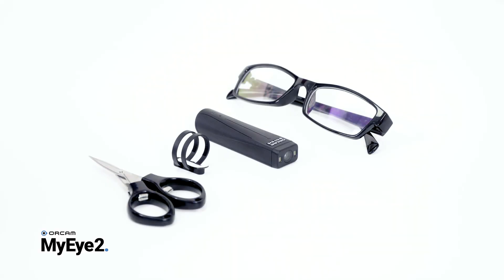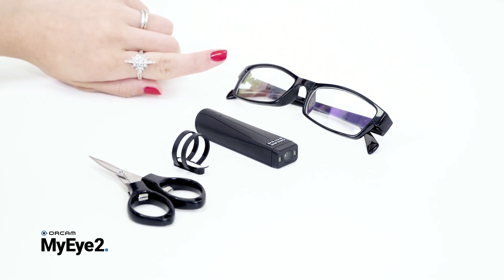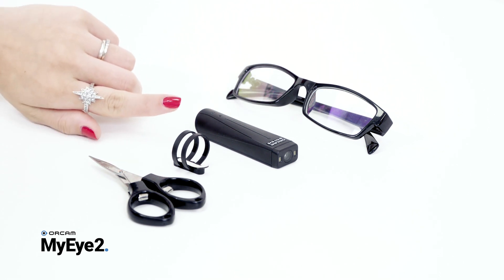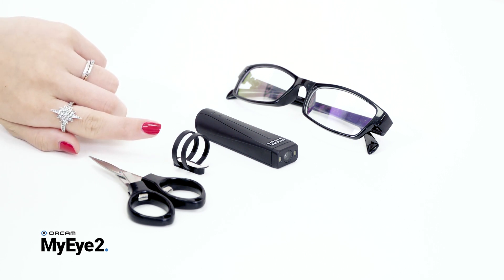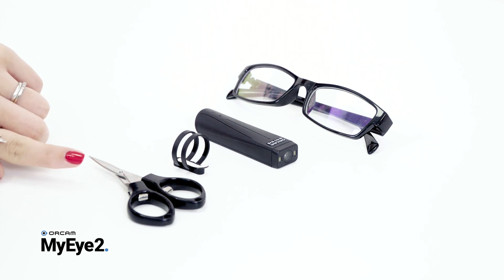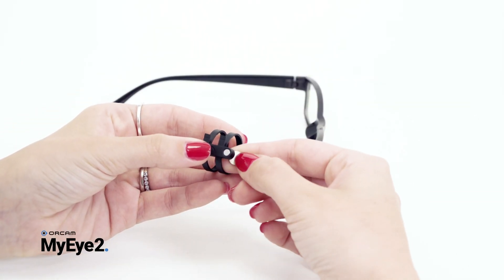For the mount assembly on your glasses frame, you will require your glasses frame, your OrCam device (preferably powered off), the partially assembled plastic mount, and a pair of scissors which are provided in the delivery box.